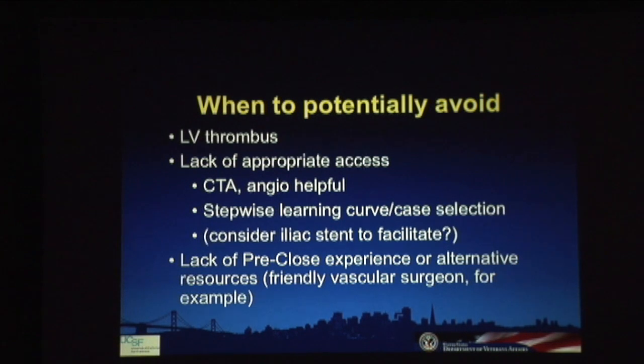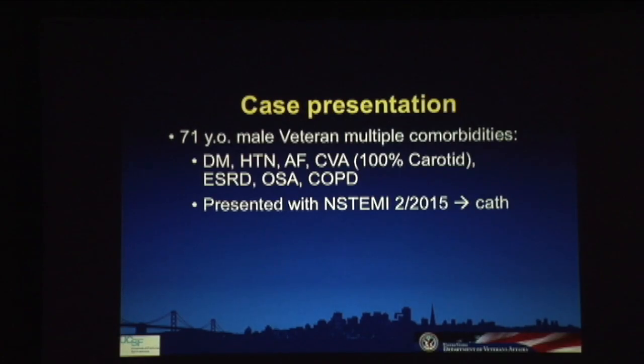And then, of course, this relates to the learning curve, but I think it's been emphasized how getting these things out as soon as they're not needed anymore is important. I'm a firm believer in that, especially for the elective cases, to support you through a tough elective case. I think it's important to master pre-close, whether you mastered that through peripheral skills or whatever, or to have some other strategy where you can feel very confident in getting in and out of these arteries with 14 French access. So I'm going to show a case here to try to illustrate some of this.